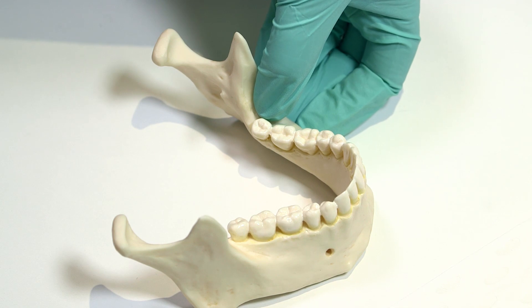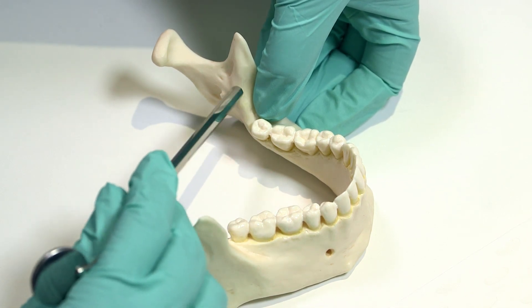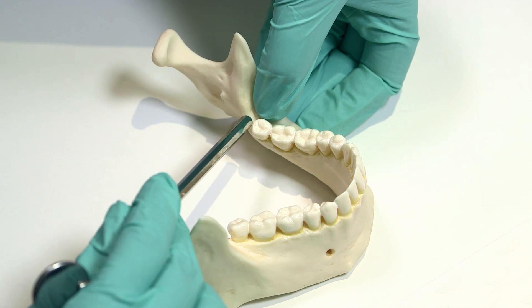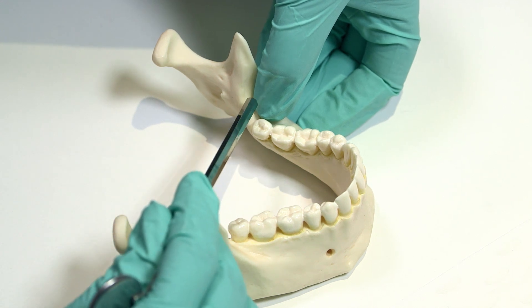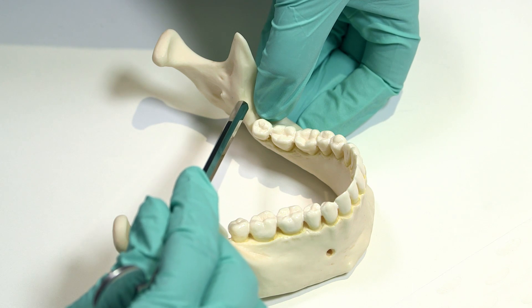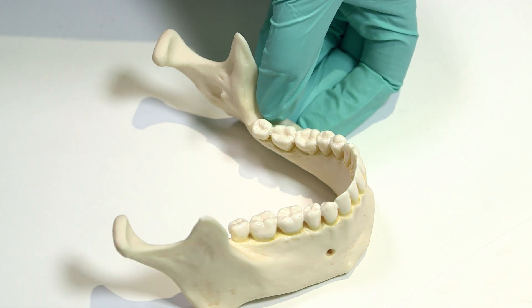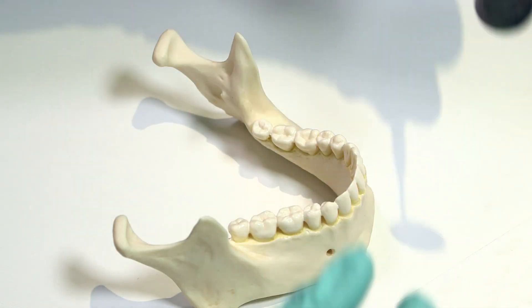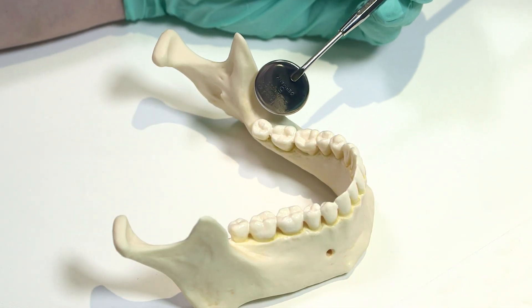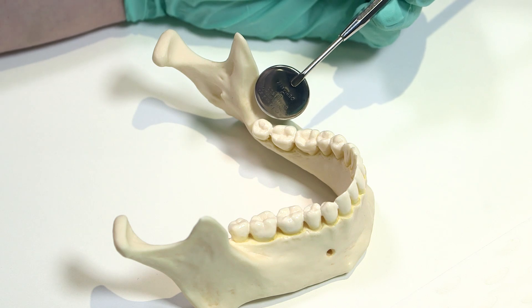Then we're going to identify the pterygomandibular raphae, which is the soft tissue band running along here, and the pterygotemporal depression lateral to the raphae. We're then going to use our mirror to retract the soft tissue — we never retract using our fingers to prevent sharps injuries.